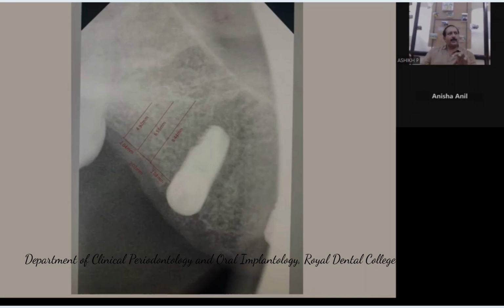What is your perception on that particular area? Can an expansion further with the implant, when it goes into place, cause much harm, or will it cause a fracture line within that bone area or beyond that area connecting the implant? It's all your decision now. It's the clinician's decision that is going to be the prime matter here, or the only matter. If you found that area to be soft enough, less dense, you can go in for an implant here directly. So that means it's going to be 3.6 plus directly implant.